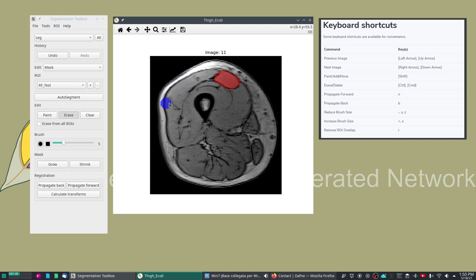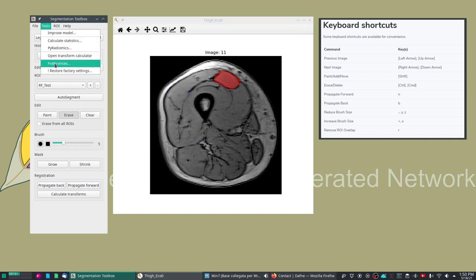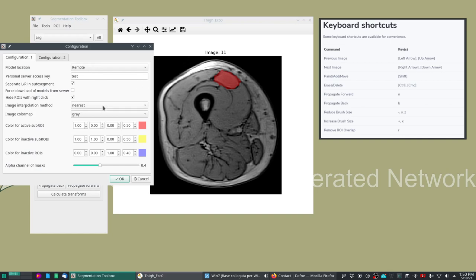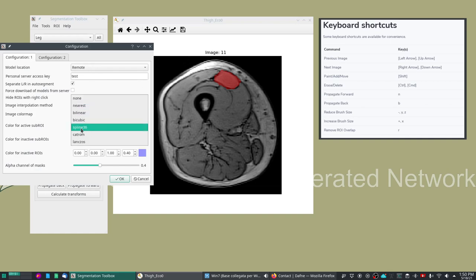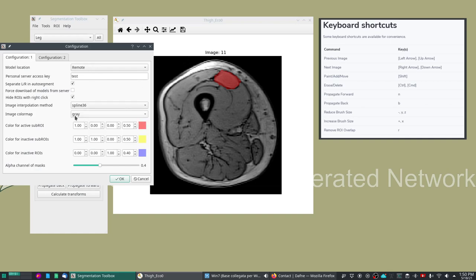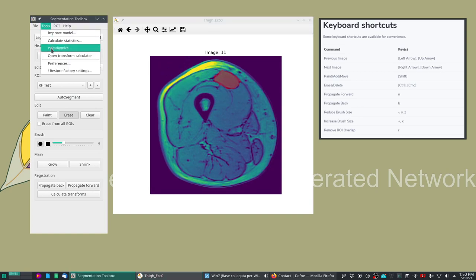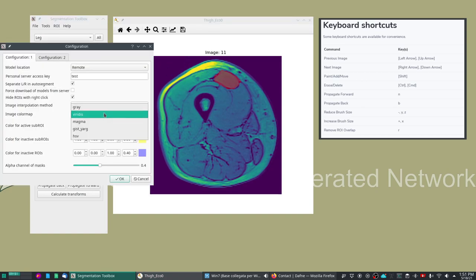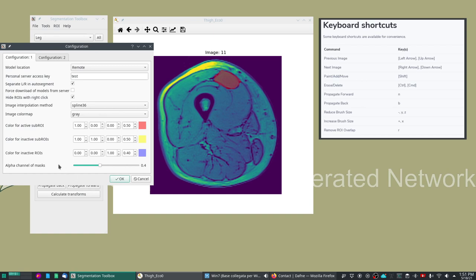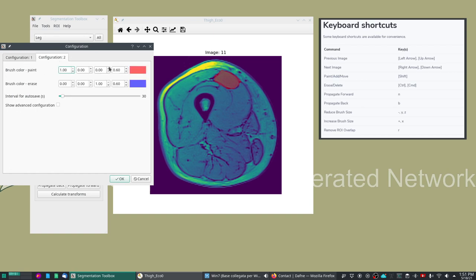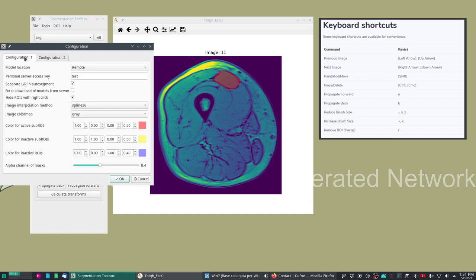For example you can replace it to nearest neighbor interpolation and now the image has become pixelated. It's not as nice to see but sometimes it's useful if you want to be pixel exact in the segmentation. The default is spline 36 interpolation. Similarly you can also change the color map. You will also have some possibility of changing the colors of the active and inactive ROIs and the colors of the brushes. There is some advanced configuration but this is mostly for internal use.